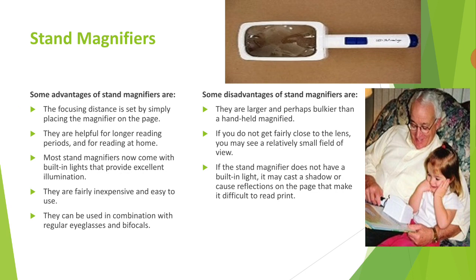So anyone can buy this. Three, they can be used in combination with regular glasses and bifocals. So you can use your eyeglasses or bifocals with your stand magnifier.